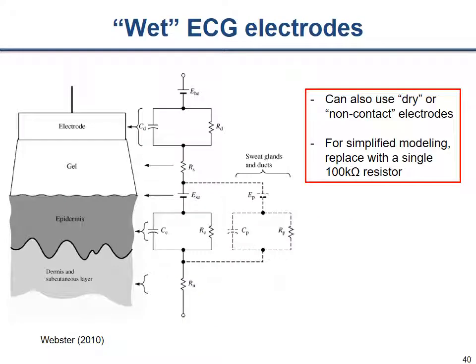Now, the other thing we have to think about is how are we physically interfacing to the body? We want to put an electrode on the body. If it's non-invasive, we can only interface with the skin or the epidermis. And we want to put some sort of metal, some conductor onto the body. Because the epidermis is not a flat planar surface, it's curvilinear and can be rough, it's not a classic electrical connection.